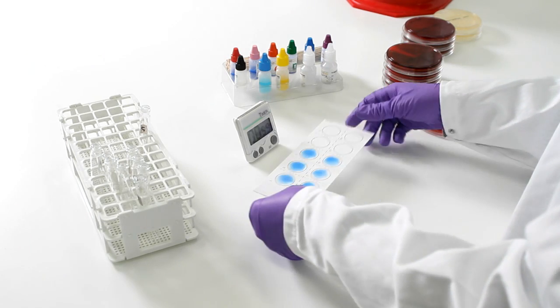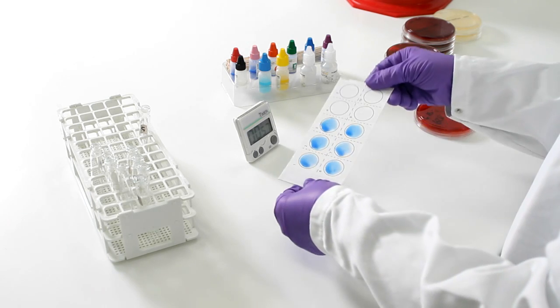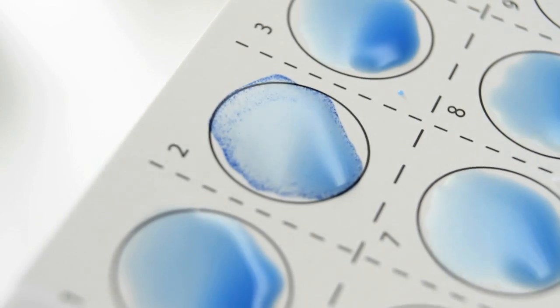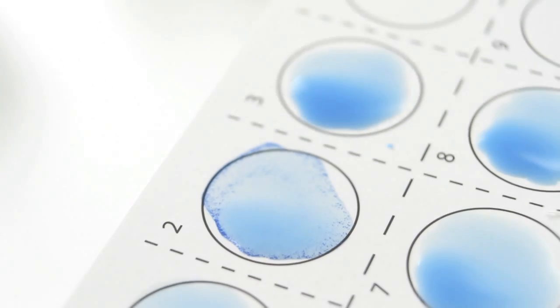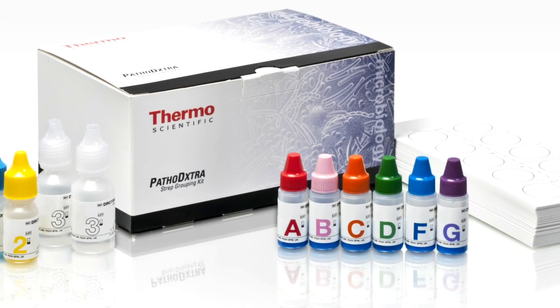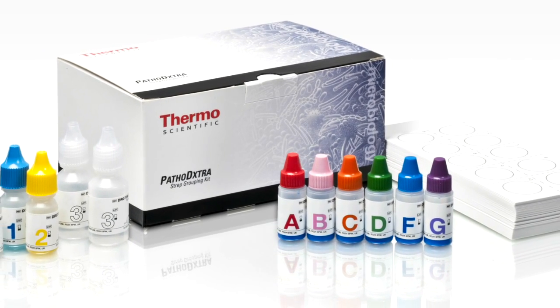Rock the card and examine for agglutination of blue latex against a white background, which makes reactions even easier to read. For the complete, faster approach to strep testing, use the PathoD Extra Strep Grouping Kit.